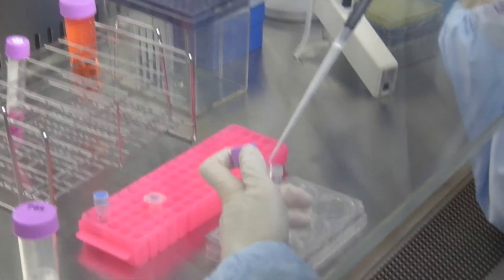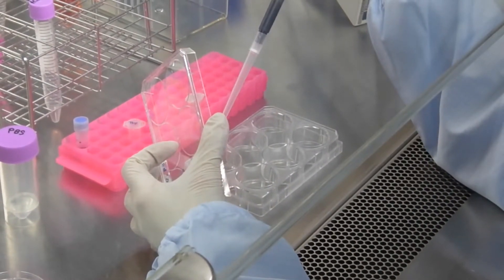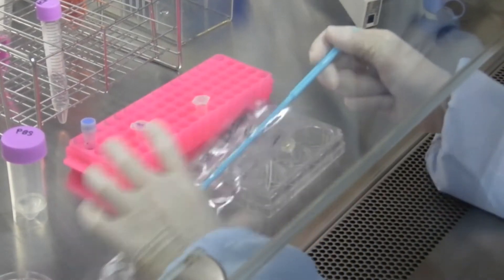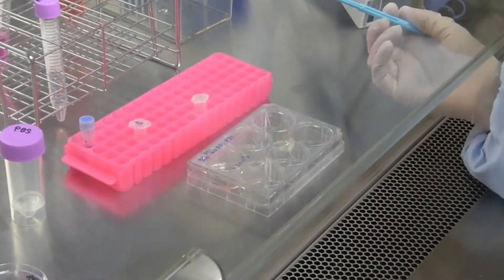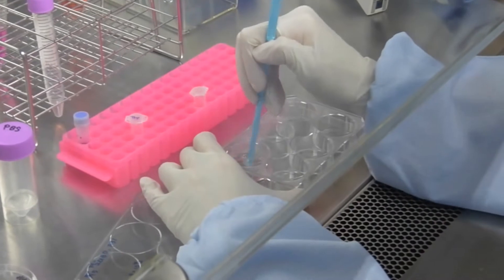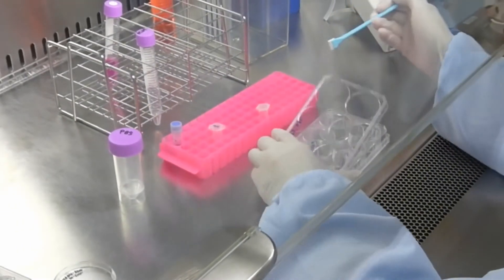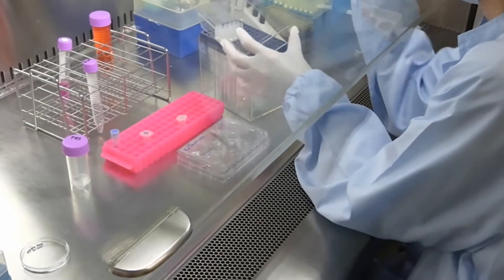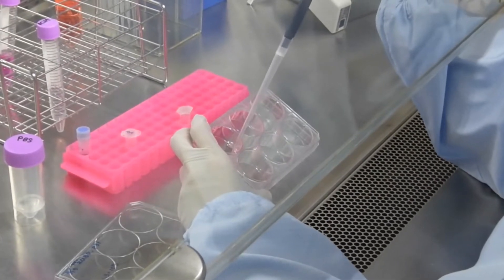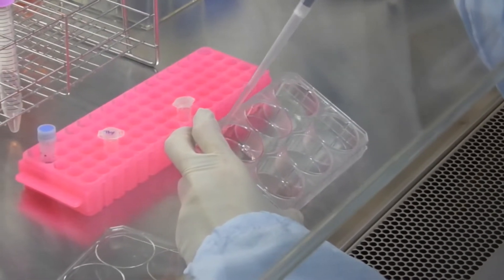After washing, add 1 mL of StemFit medium. Then, iPS cells are peeled off with a cell scraper. Disperse iPS colonies by pipetting gently 10 times with a micropipette attached to a P1000 tip to separate iPS cell colonies into single cells, and transfer them into a new microtube.